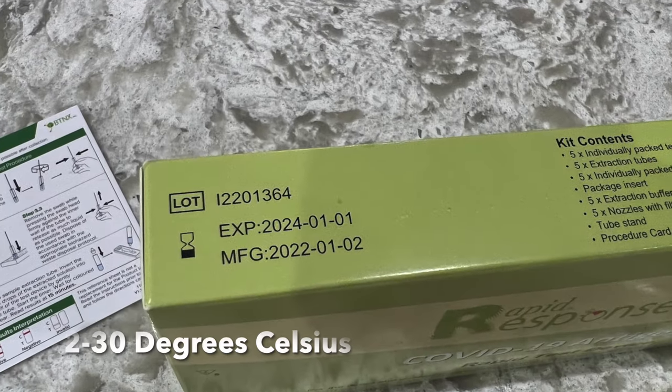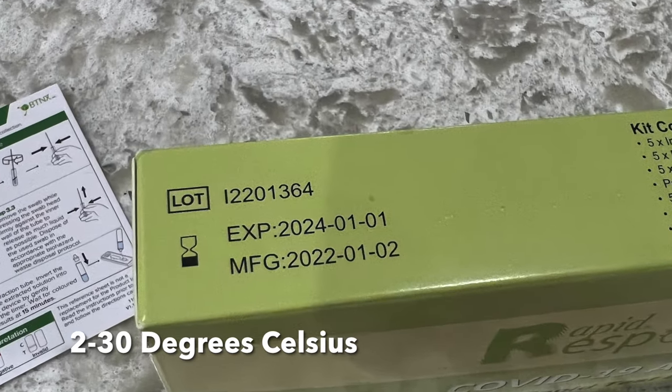The test kits are stable at 2 to 30 degrees Celsius until the expiration date on the box, as seen here.